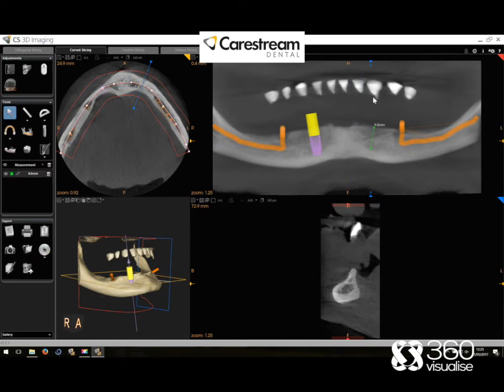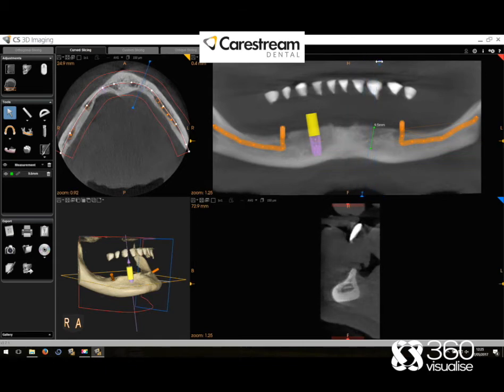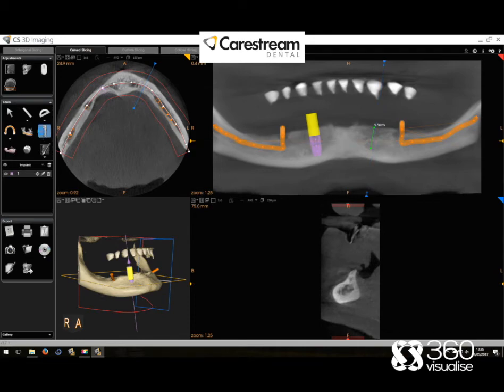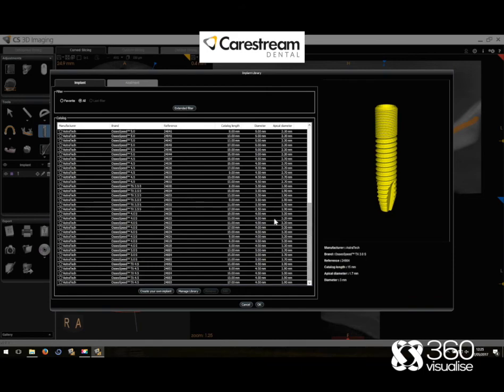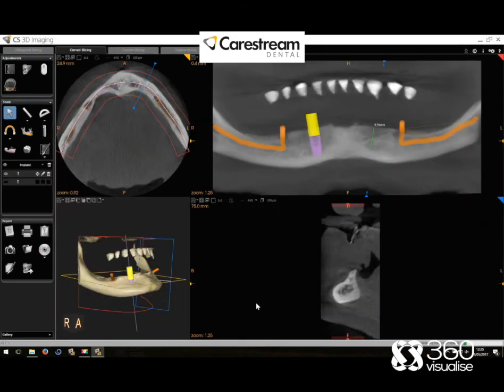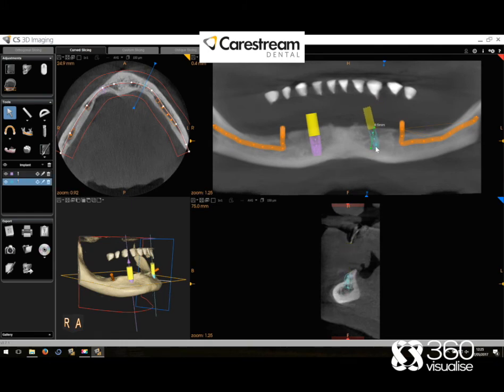As well as the measuring tool, there's a full implant library and you can download pretty much any implant directly into your library free of charge. Once you place the implant it's very easy to manipulate it and move it around to get into the ideal position, and with a future release of software you'll be able to export that directly into BlueSkyBio or SMOP, or whichever open guided service system you want to use.